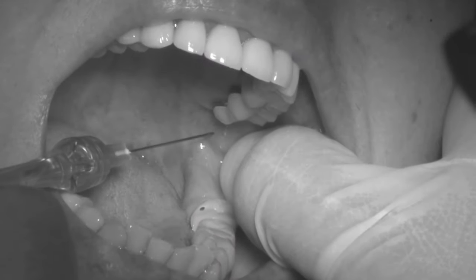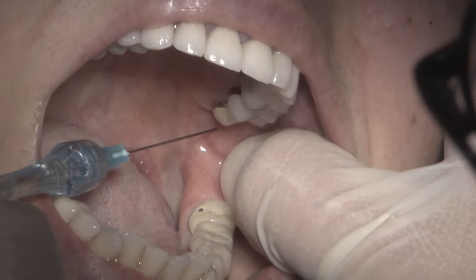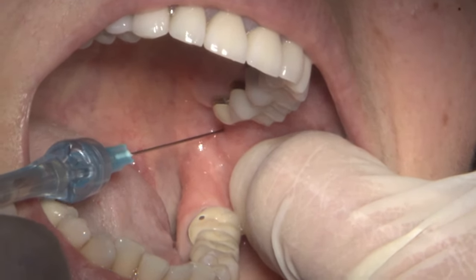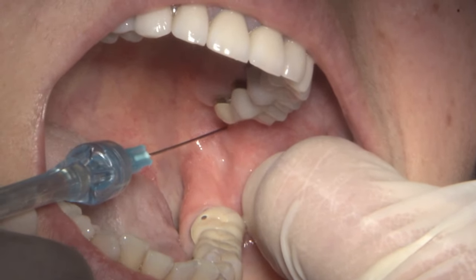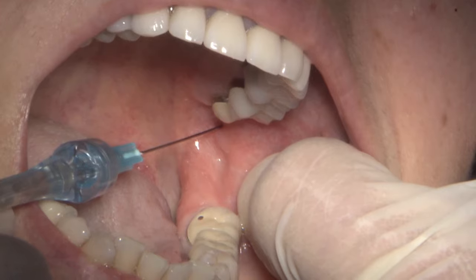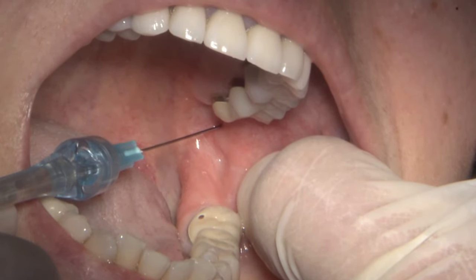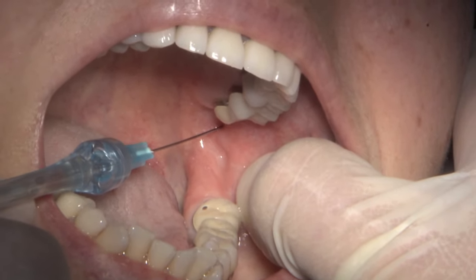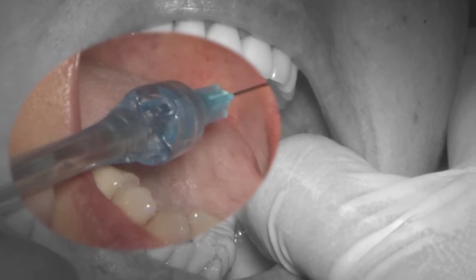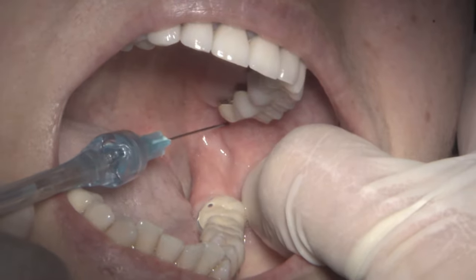How are you doing? You're good right there. Then go ahead and start to twizzle whenever you're ready, and just keep your focus on where that location is near the condyle.